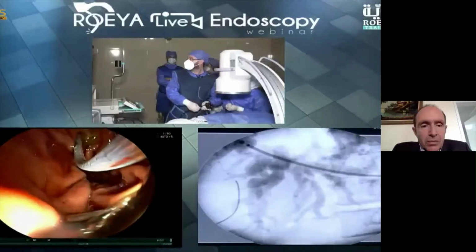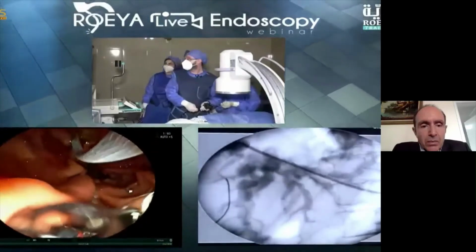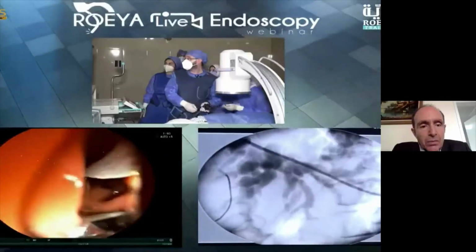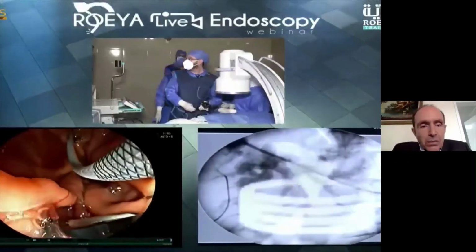Now we have the stent. We can leave it in the long position, so we can actually see the distal release of the stent. Now we have the distal part of the stent seen at this part. Do you see it? Okay. Now we can start deployment under endoscopic and fluoroscopic guidance. I will ask my assistant to slowly open the stent. Okay, wait a moment. Okay, open.